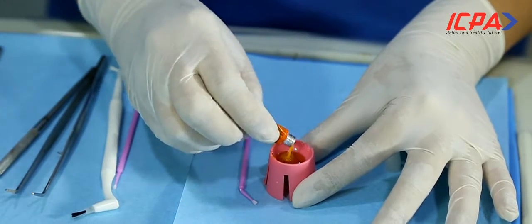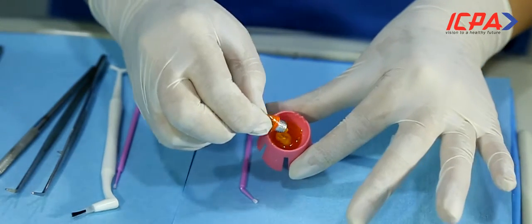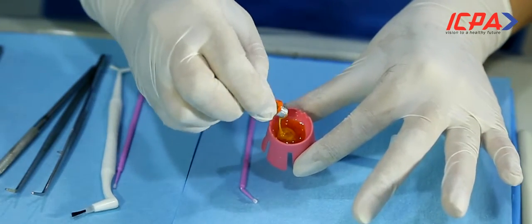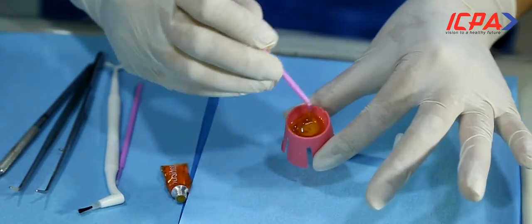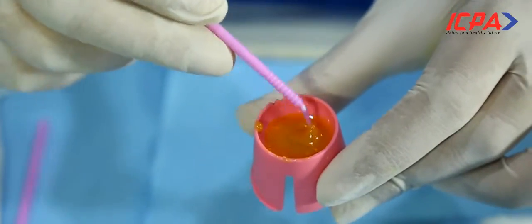Mix the fluoride varnish well, because a lot of the time it separates. We can see how it is not mixed right now, so make sure you have a good and even mixture. Fluoride varnish is directly painted on the tooth surface.